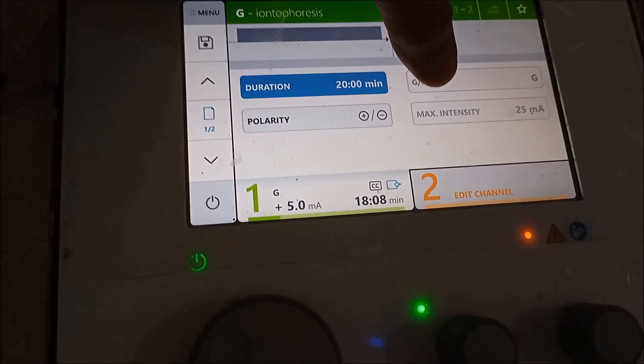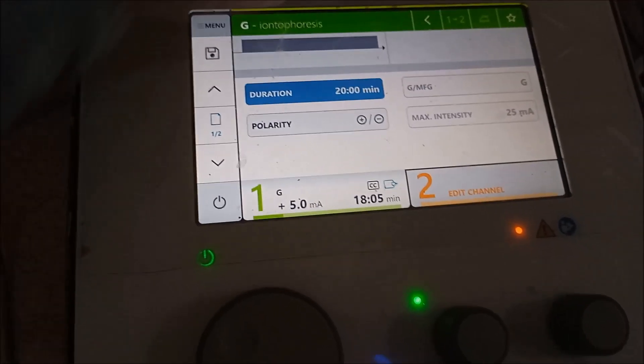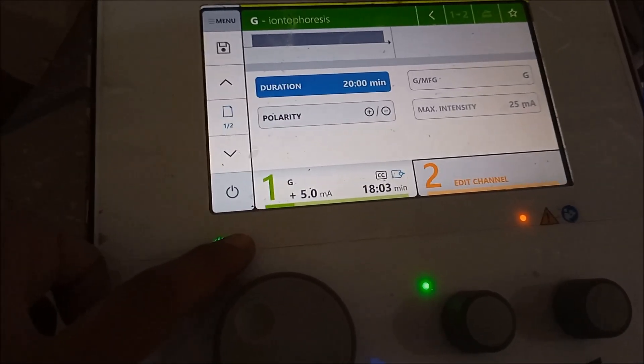Here you can see this mode is set to 25 mA maximum and currently we are treating the patient at 5 mA.